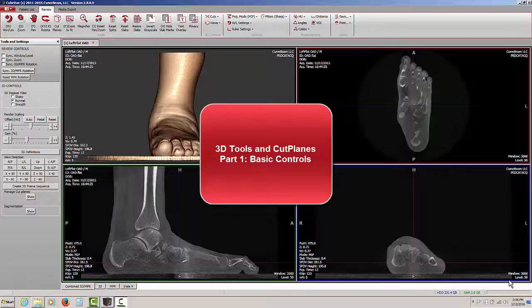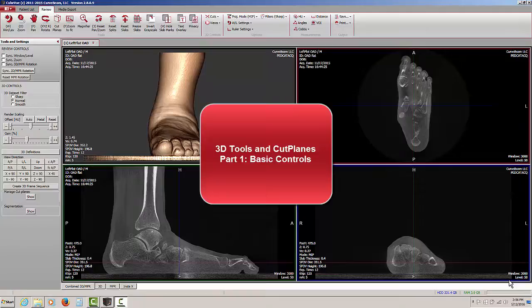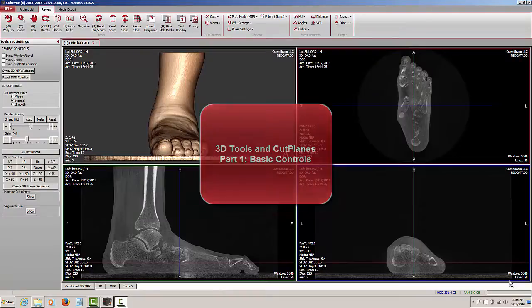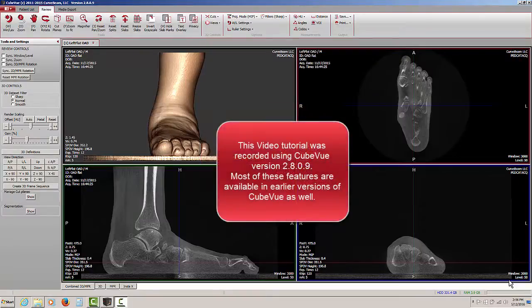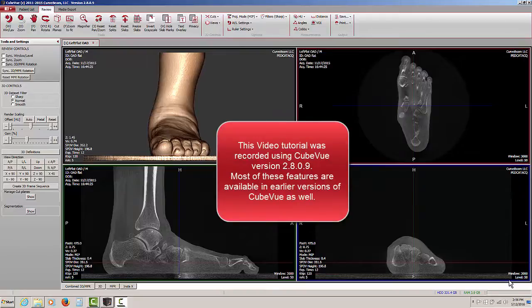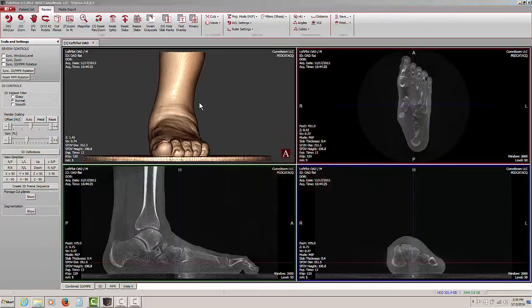The purpose of this video is to familiarize the user with the basic 3D rendering controls. This video was recorded using CubeView version 2.8.0.9. Most of the features described in this video are also found in earlier versions of CubeView.